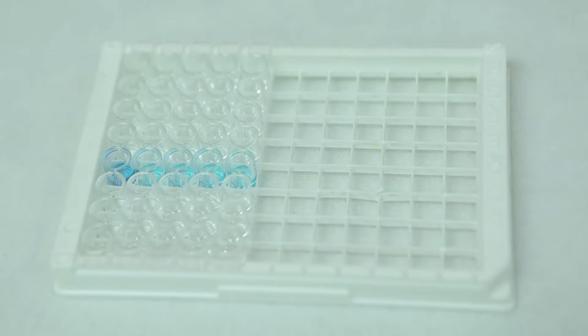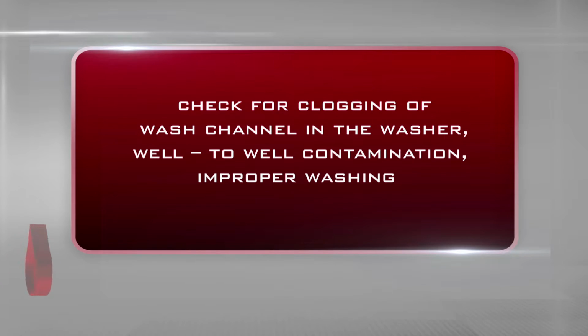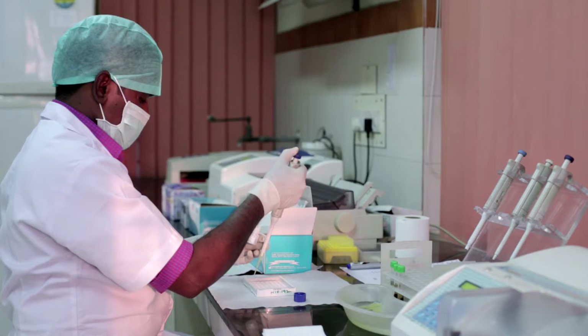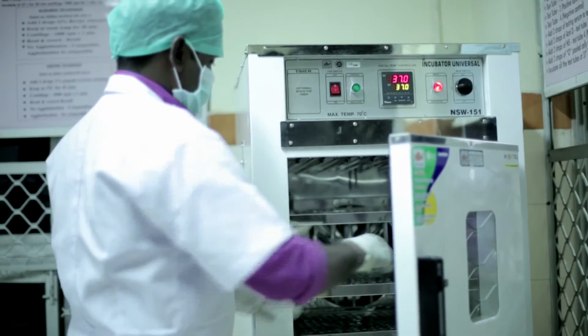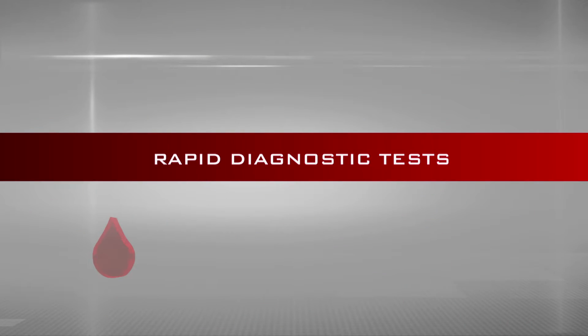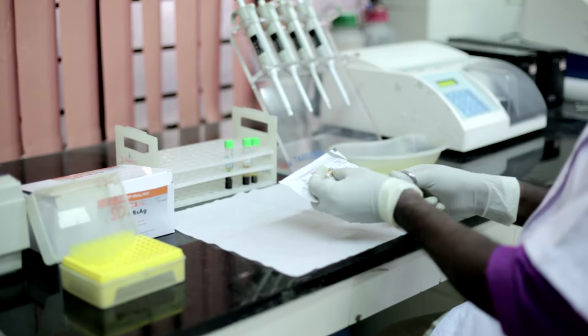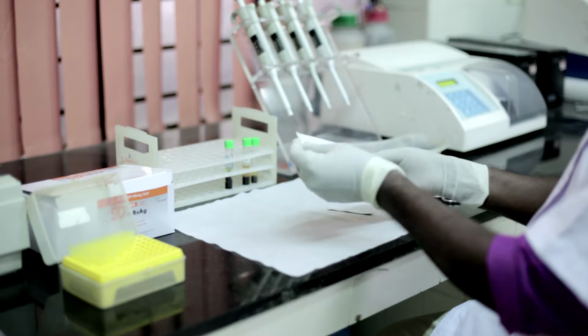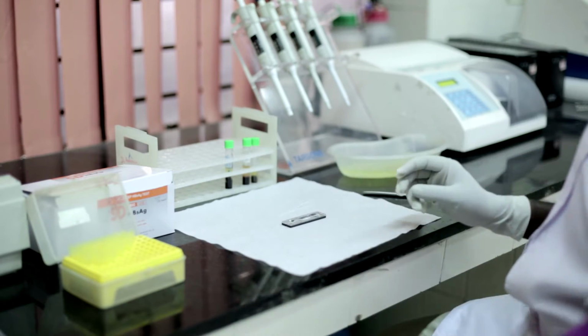Likewise, if there are bad results in one column or row, check for clogging of wash channel in the washer, well-to-well contamination, improper washing. Always remember, even this third generation ELISA testing cannot detect the antibodies during the window period. Rapid diagnostic tests. When ELISA testing is not feasible during emergency situations, rapid diagnostic tests based on immunochromatography is done.